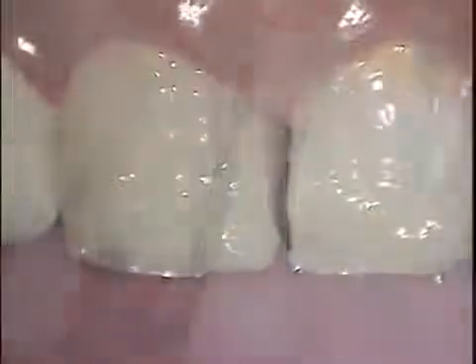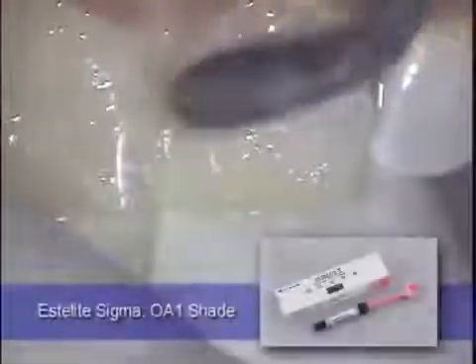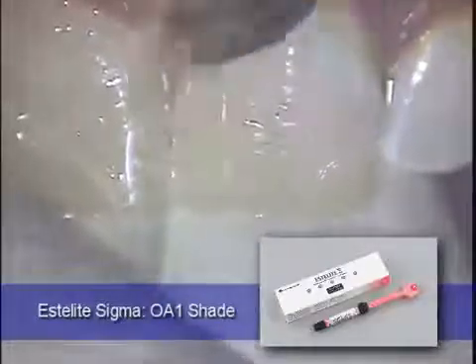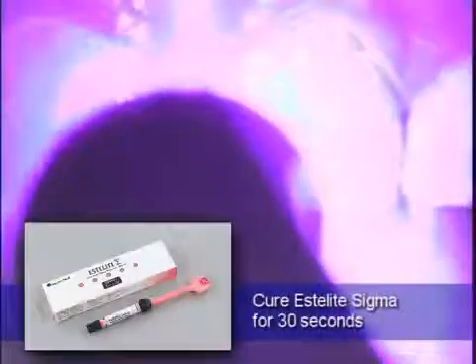Here, the putty matrix is now removed, and the midline finally closed. A mylar strip is placed between the two central incisors, and Estelite Sigma in the OA or opaque A shade is placed to prevent any gray shining through at this area.